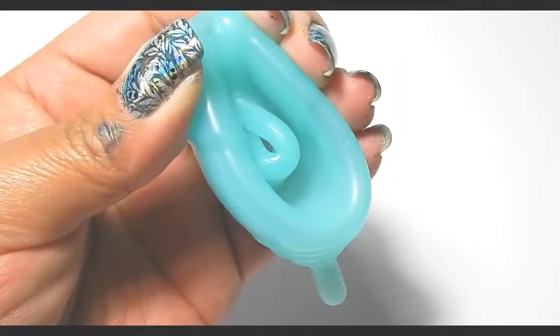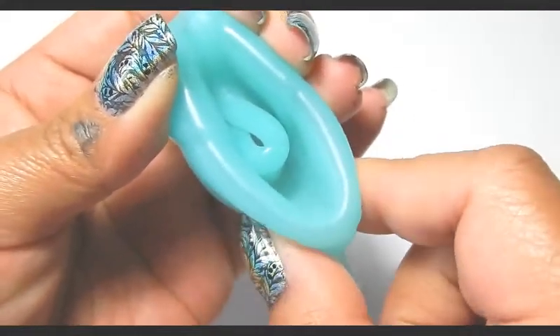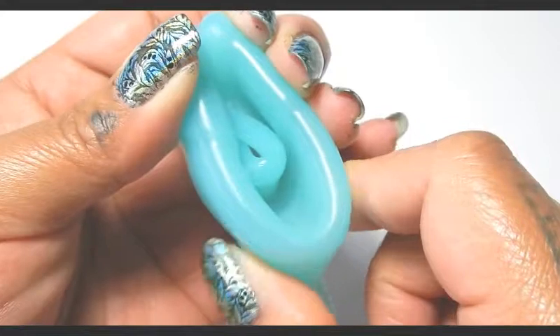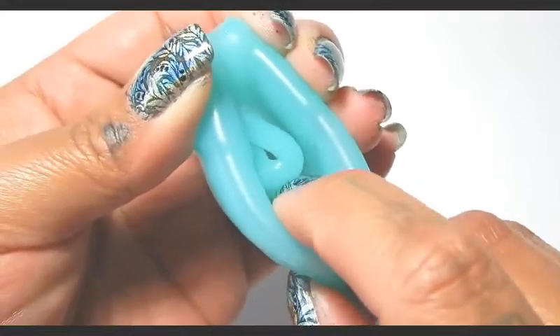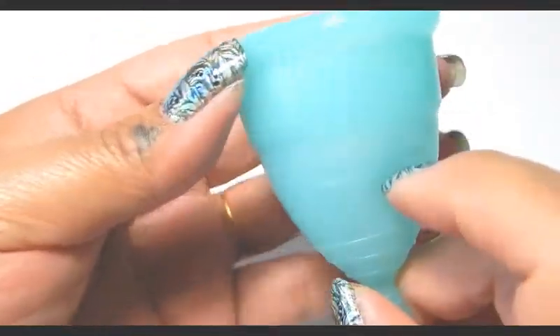After you get the labia fold inserted, you can reach in with two fingers to press the bottom of the cup where the grip rings are, to push that rim open. Or you can insert a finger and nudge the rim that's pinched on the inside to pop it open.